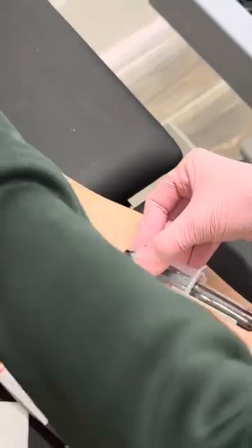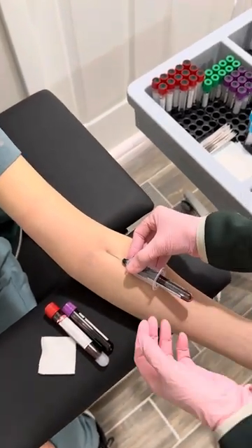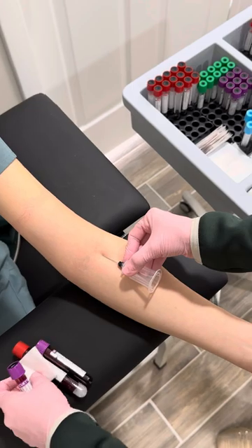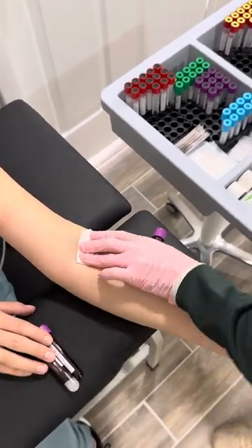This one's halfway full so I'm going to go ahead and take her tourniquet off. And why do you do that? So that it won't squirt out from the pressure.